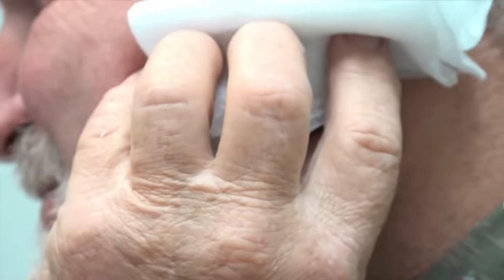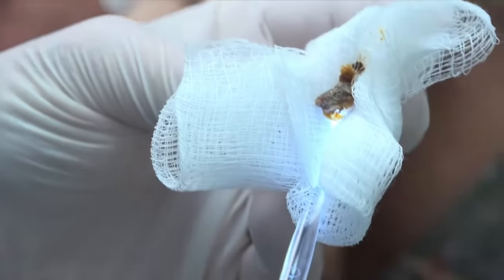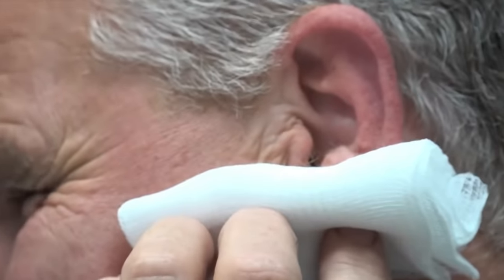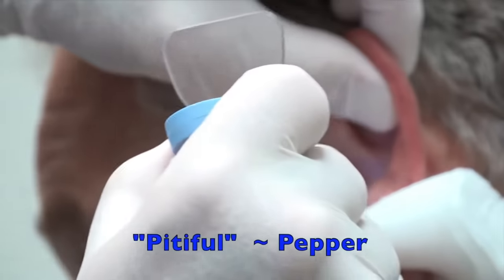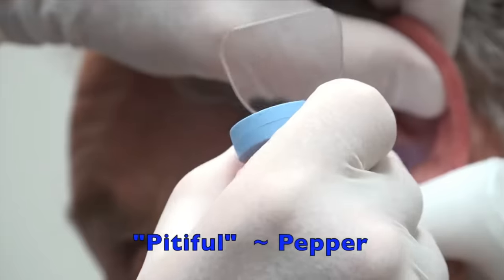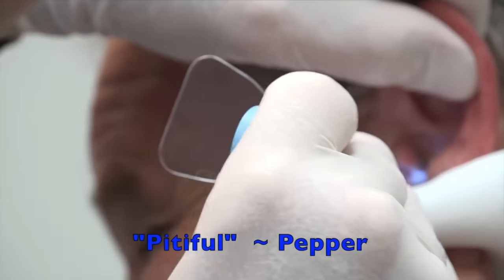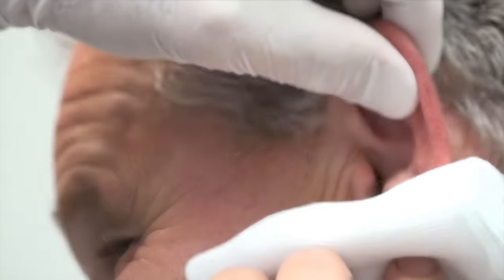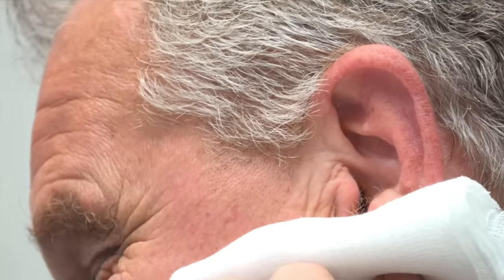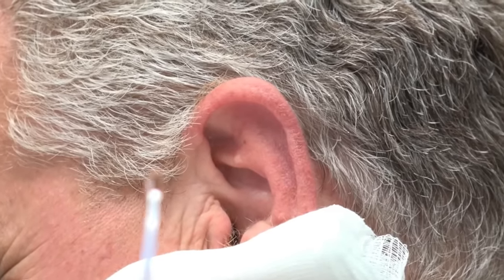See that? I can't see it. There it goes — there it is. You want to see it? Pretty surprising, isn't it? Pitiful. Let's take another look in there. He said it was pitiful. I think you've got some more right there — there's some more, see that? How long does that take to build up? Well, everybody's a little bit different. For some people it can happen in a period of a few months; for others it can take years.